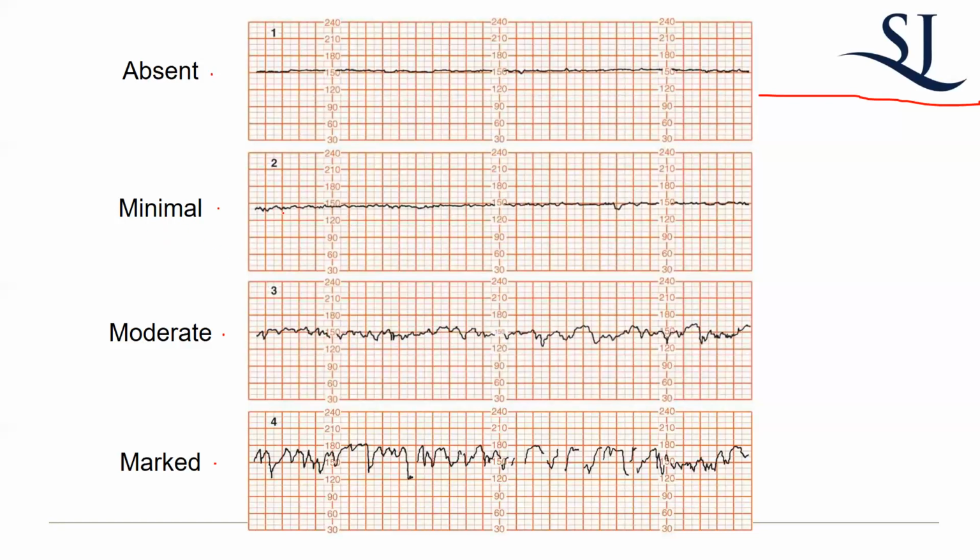Like here, for example, this is a normal baseline, right? What would we say this baseline is? Yeah, 145, 150, probably 150 more about here, but before that, it's fine. So you're not too concerned about this.